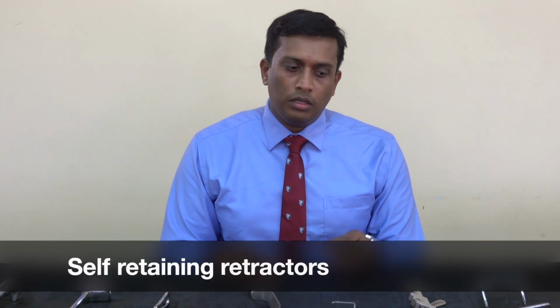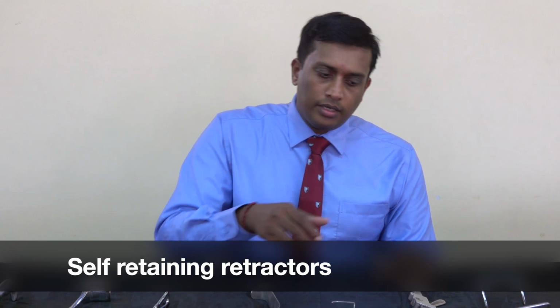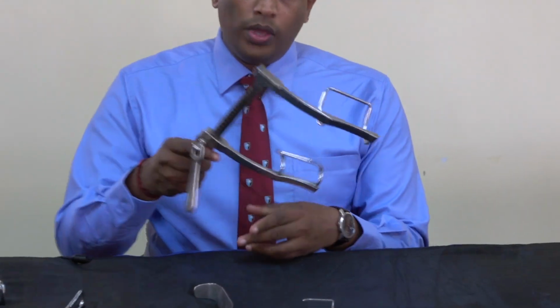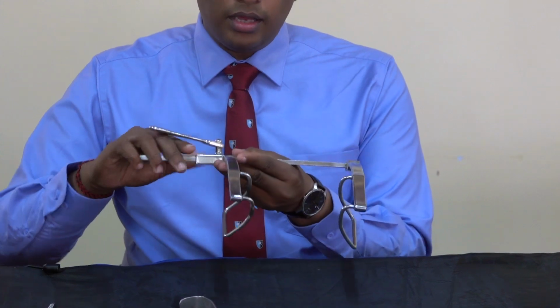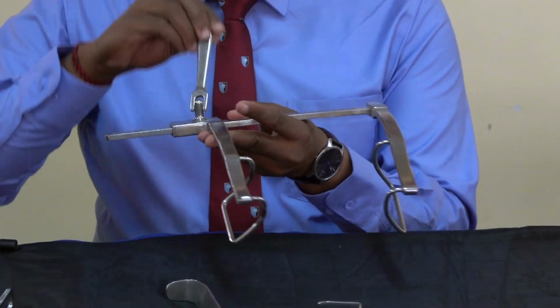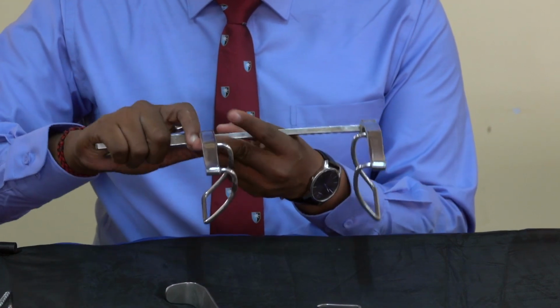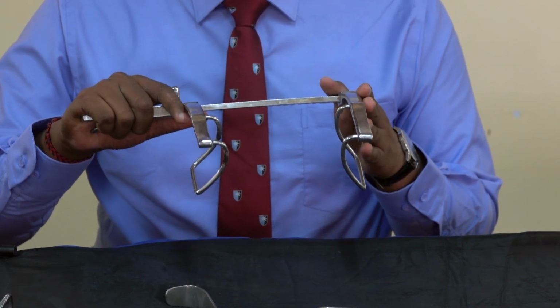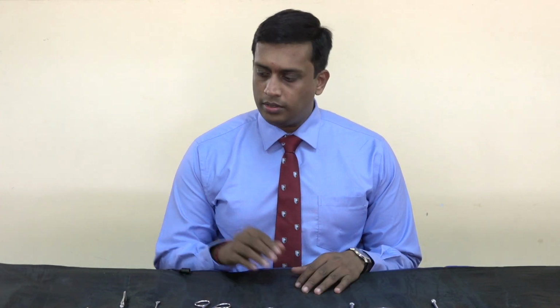There is another set of retractors called self-retaining retractors. That is, after the dissection of the layers, we can fix the self-retaining retractors, and we can change the size and shape and fix them. Then it will permanently hold the surgical field until the surgery finishes. Finally, we will see some miscellaneous surgical instruments which are commonly used in obstetrics and gynecology.